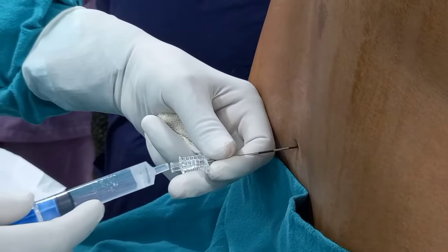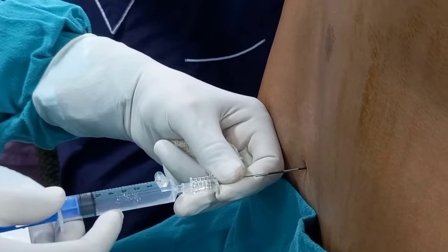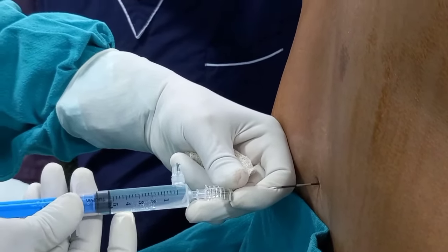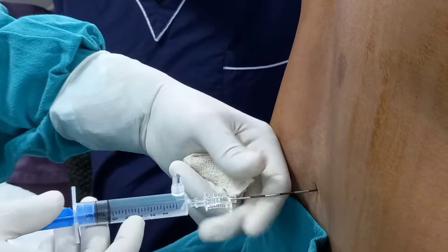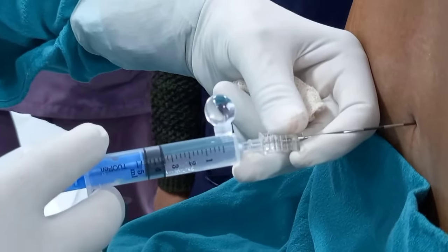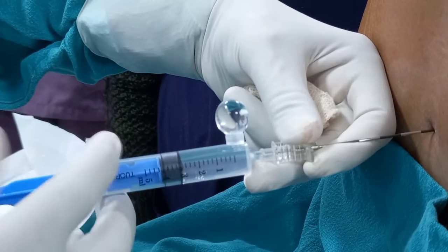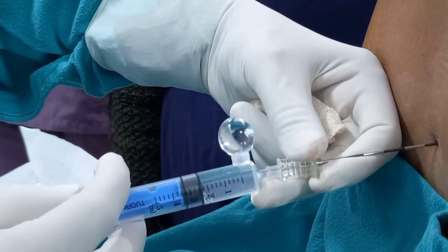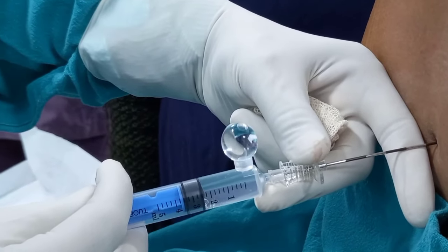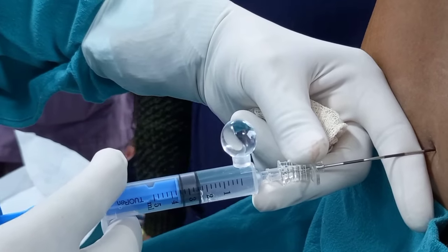This syringe has a special incorporation of a balloon. Press the plunger up to 1 to 2 ml mark, by which the balloon is inflated. See the balloon is being inflated and holding in position.